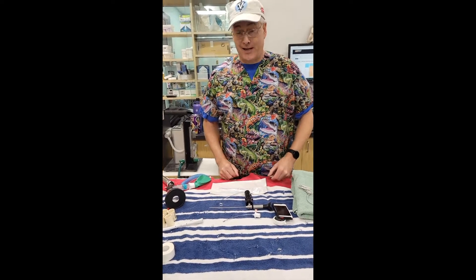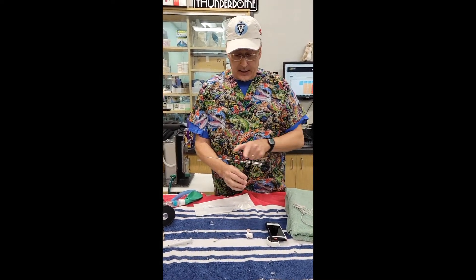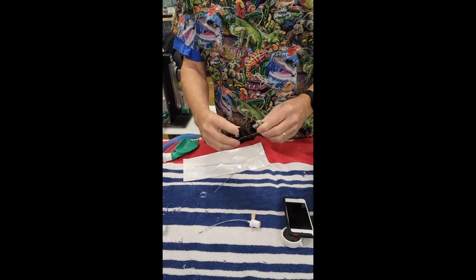Welcome to Ugly Scrub Day at Avian Exotic Animal Care. We're going to be intubating a rabbit today using a MDS 1.9 semi-flexible endoscope with a small light source.